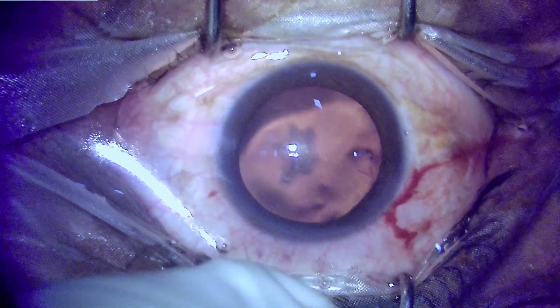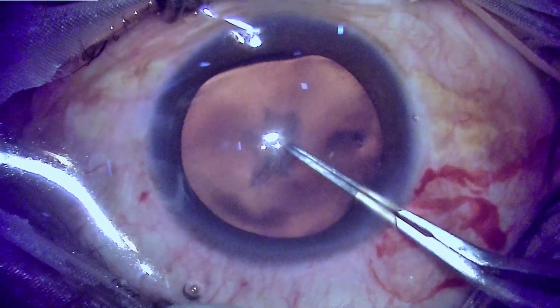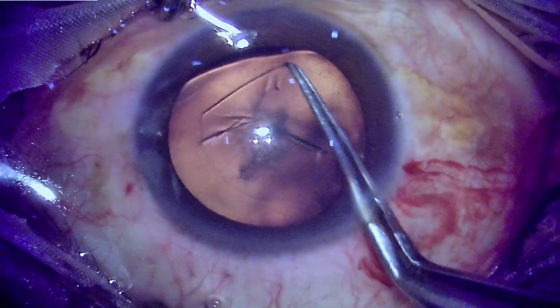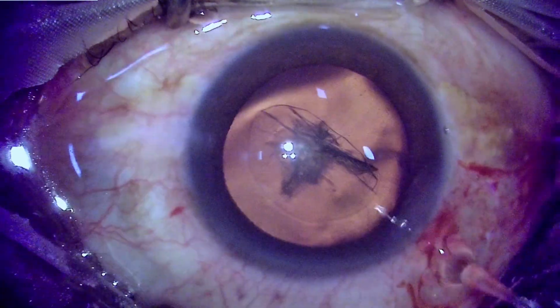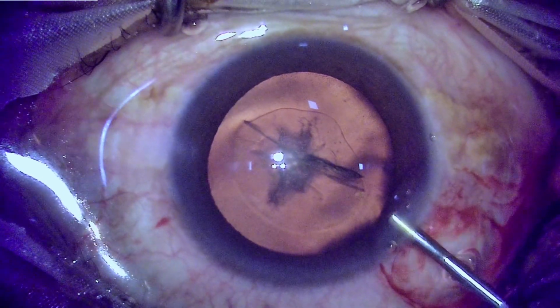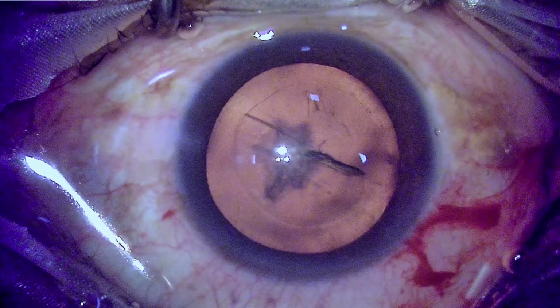So the first step is to do a capsulorhexis, for which viscoelastic gel is injected into the anterior chamber, and now we are proceeding to make a capsulorhexis. I'll request the viewers to view this rhexis process very carefully, and we can learn a tip here. Now at this moment we can see the rhexis is proceeding, but here we can see just now that the rhexis was proceeding to go peripheral. So this was recognized well in time, and this means that the chamber is getting shallow and this needs viscoelastic supplementation, which was done.